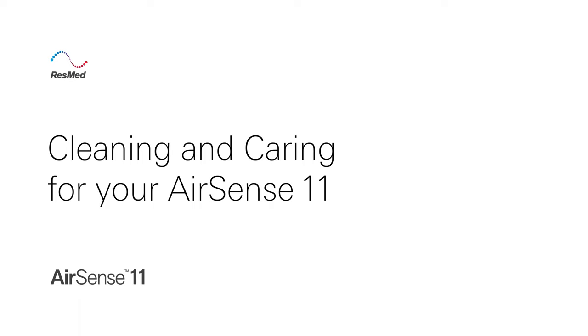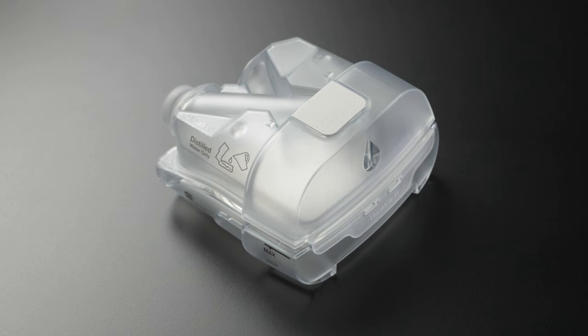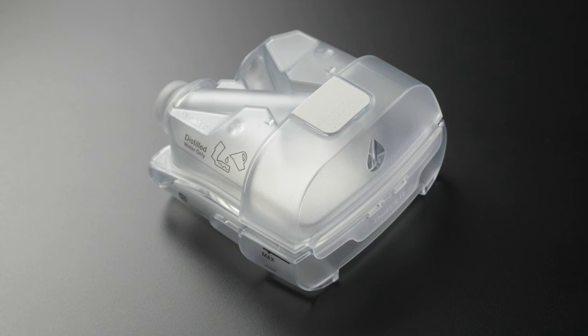Cleaning and caring for your AirSense 11. Always unplug the device before cleaning and ensure that all parts are dry before plugging it back in. Disassembling. Take care when handling the humidifier tub, as the humidifier tub may be hot. Allow 10 minutes for the heater plate and any excess water to cool.